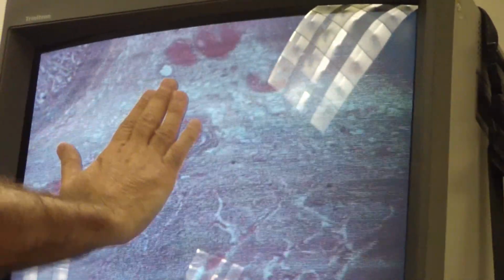From here to here, this would divide the mucosa. This would divide the submucosa. What is submucosa made of? Connective tissues, arteries, and what? Veins, blood vessels. So the mucosa, you can go this way, you can go this way. That's enough. That's the mucosa. This is the submucosa. Submucosa. And then you get to muscularis what?